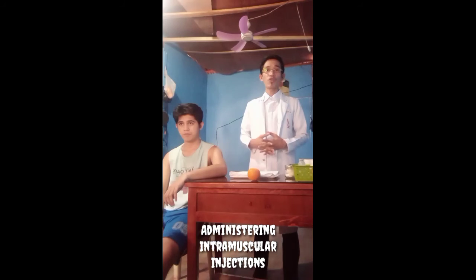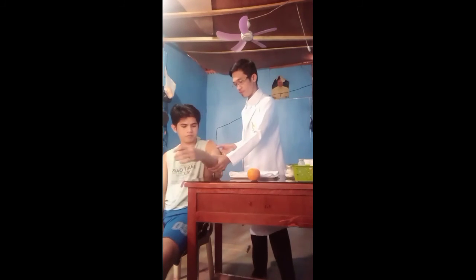Next, I'm going to proceed to administering intramuscular injection. Position the ulnar aspect of your non-dominant hand just below the site and pull the skin approximately 1 to 1.5 inches down or laterally to administer in a Z-track, just like this.